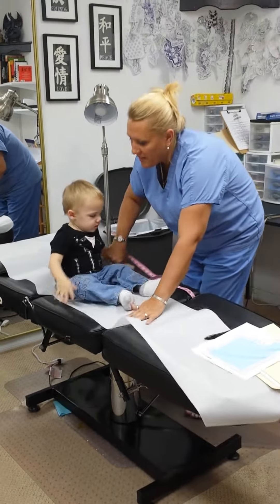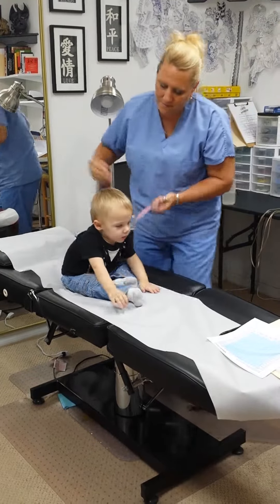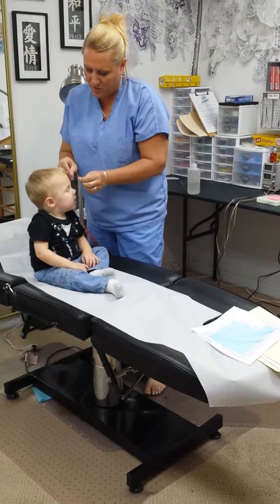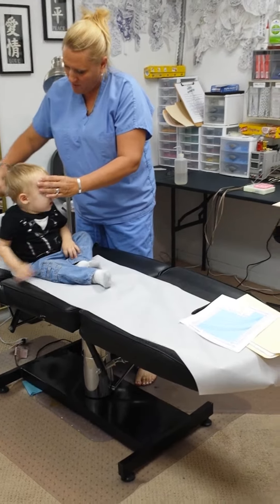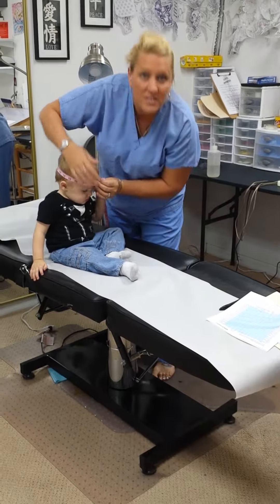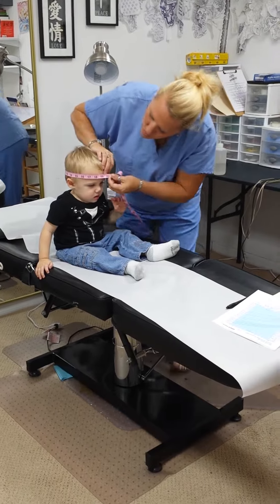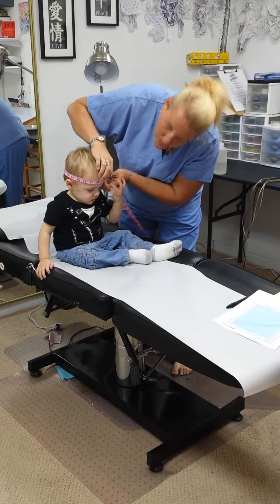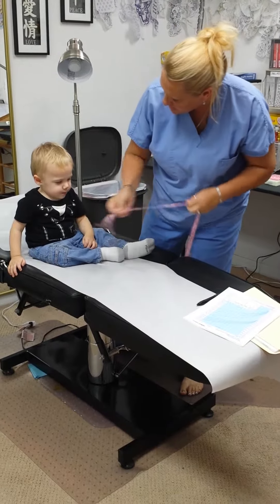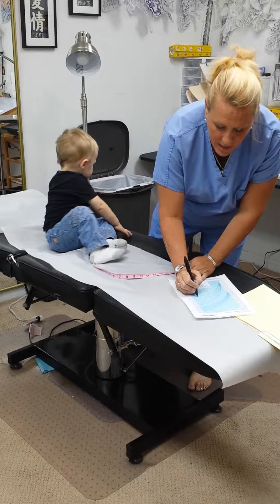First thing we're going to start with is measuring the circumference of the child's head. We're going to start with the measurement right here in the center of his head, making sure we're going all the way around and staying above his ears and above his eyebrows, measuring to the closest quarter inch. I can see here that he has 19 inches as the circumference of his head. We're going to make sure you record that down and plot it onto the chart.